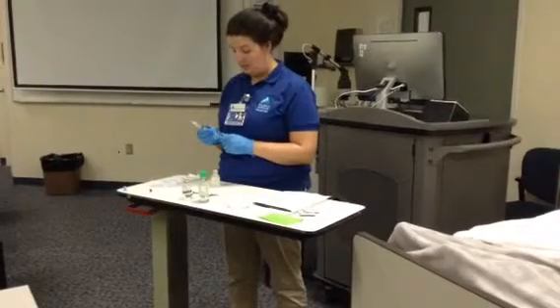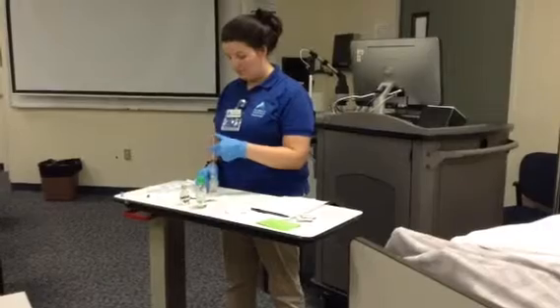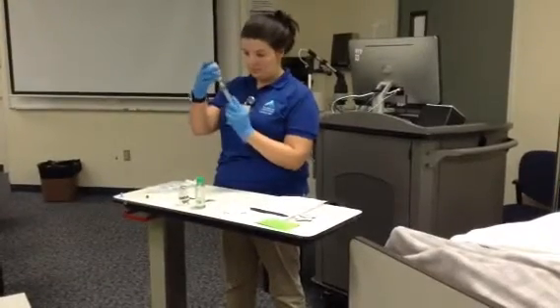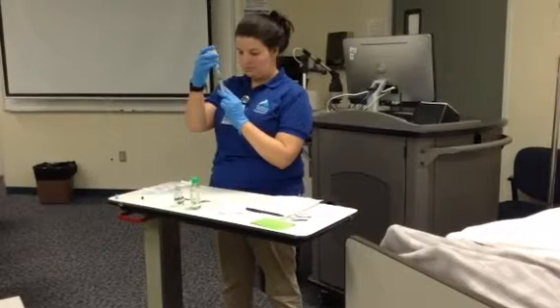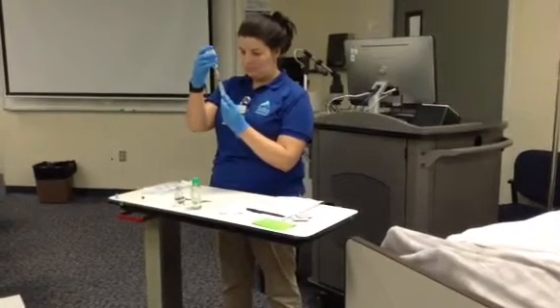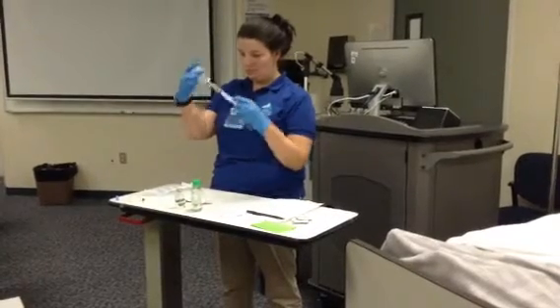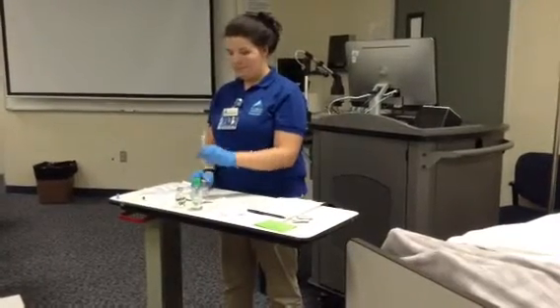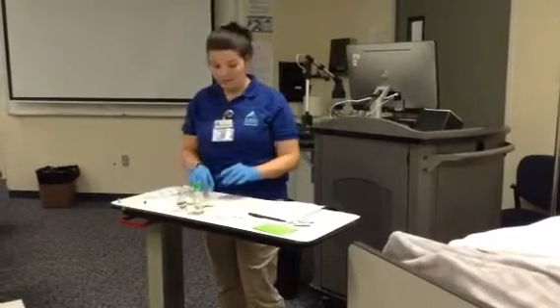I need 6 milliliters of saline. Alrighty. That would go into the sharps.